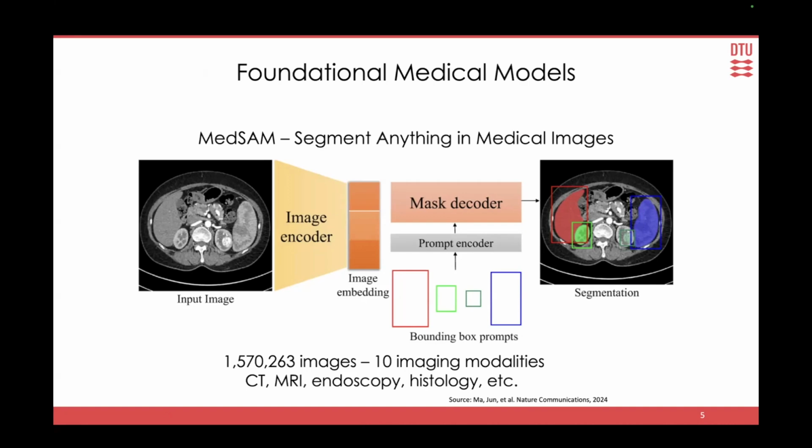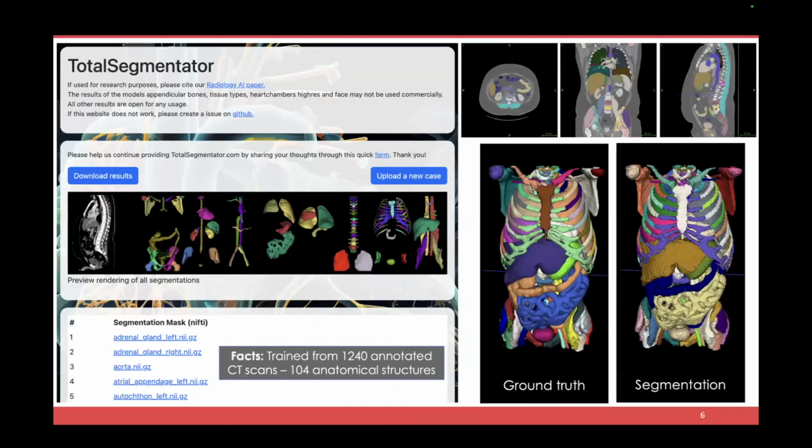And human organs at the level of a clinical CT scanner are of course limited in resolution. This is also reflected in the work done in, for example, the TotalSegmentator model, which is another quite impressive model where you segment out structures of the entire human body.